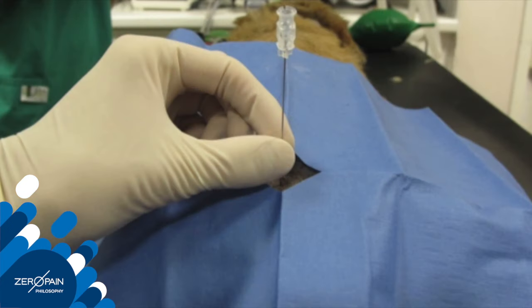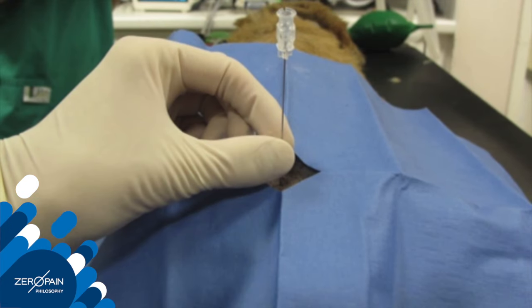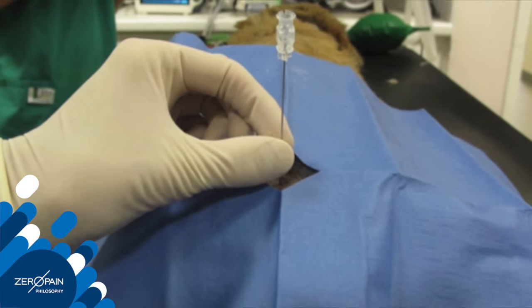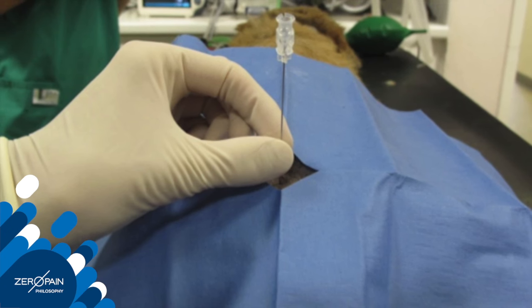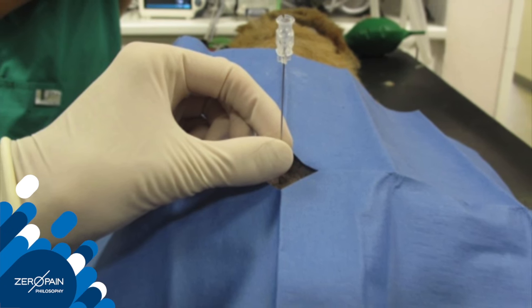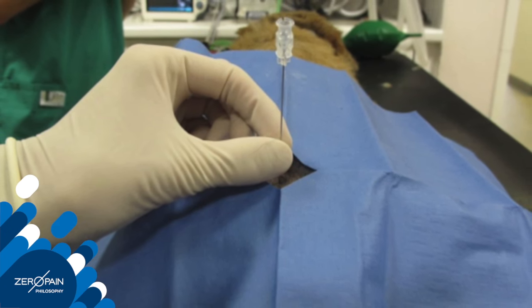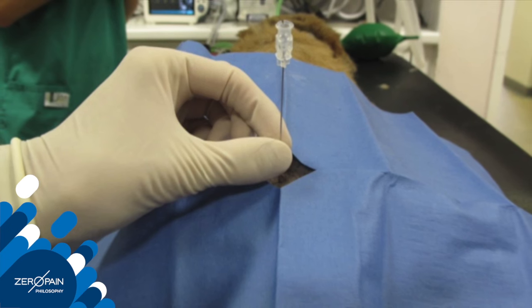In this case the needle is advanced through the skin and the stylet removed. At this point the hanging drop technique can be performed. This technique is shown in a subsequent video.